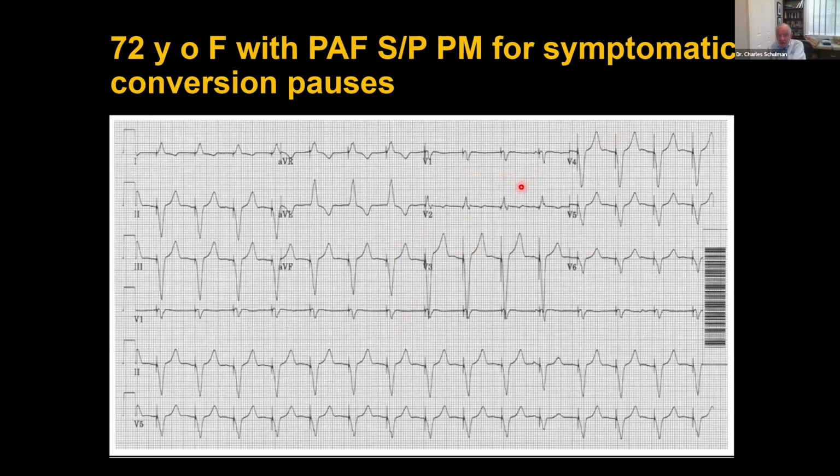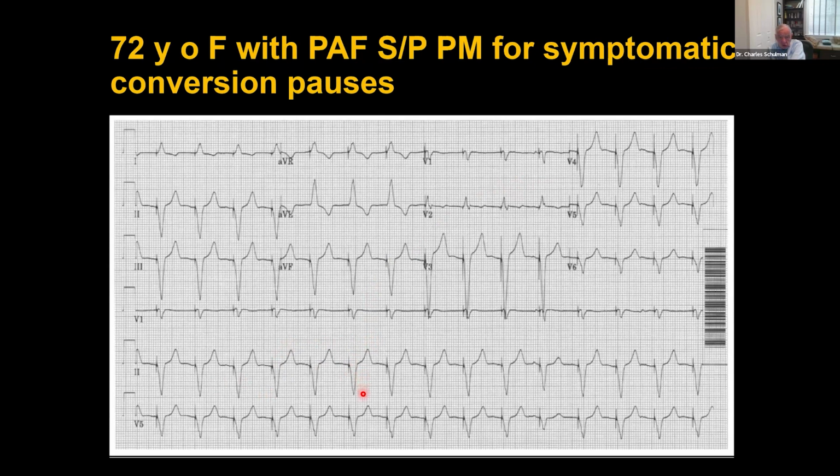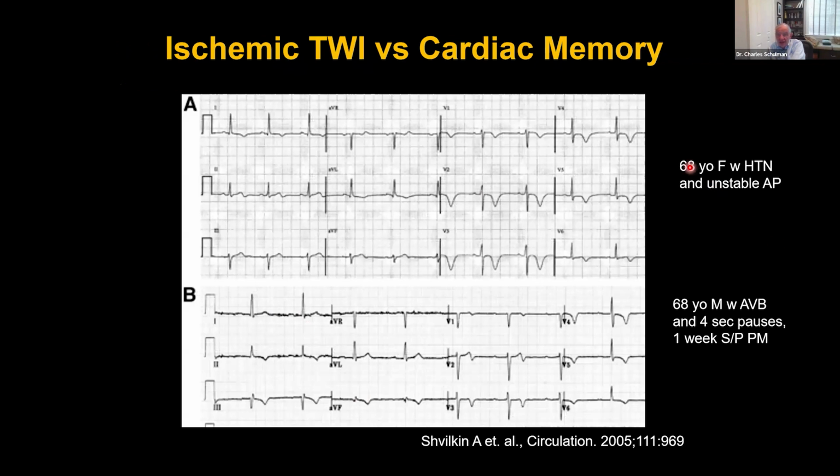Then a week later, they turn off the pacemaker. Here you can see some paced beats. Was this a dual chamber pacemaker? It doesn't look like it. Okay, and look what you see. You see some sinus beats and pauses, but you see T-wave inversions in the inferolateral leads, rather prominent T-wave inversions. Is this ischemia? No, this is a condition called cardiac memory.